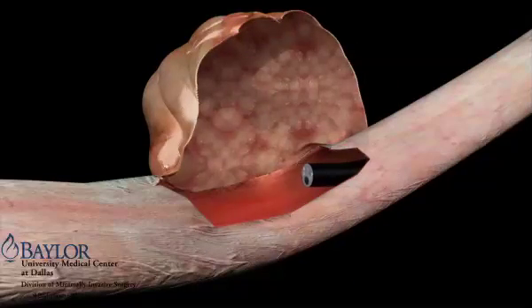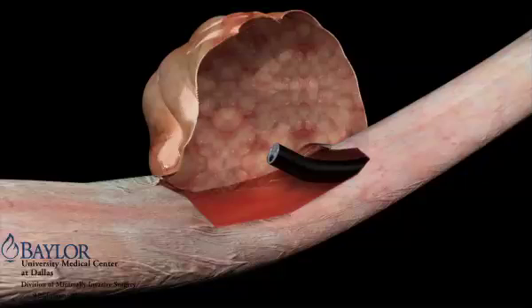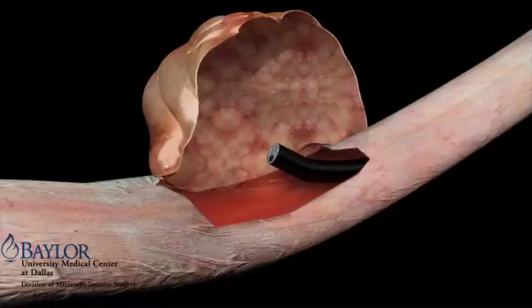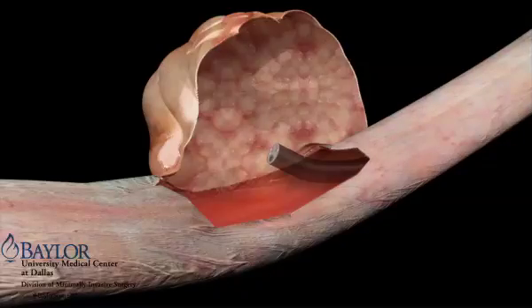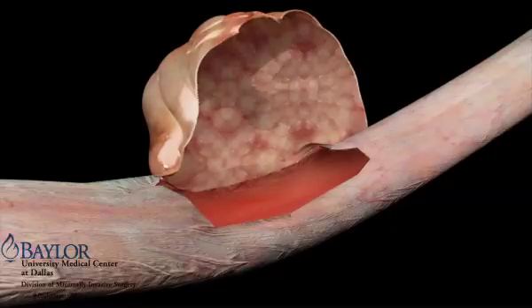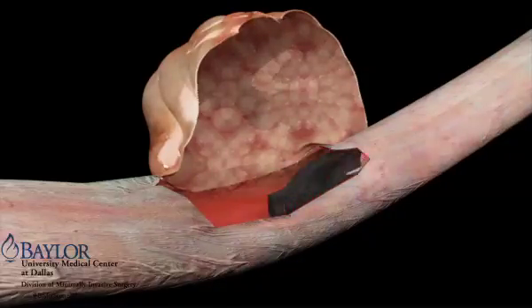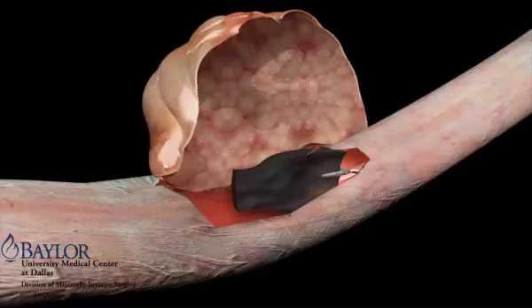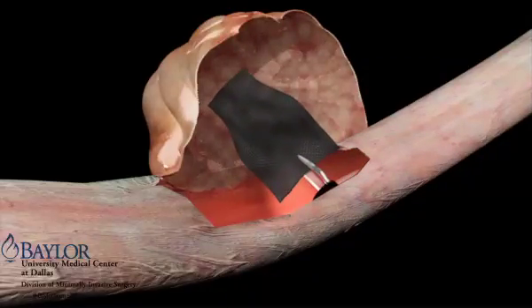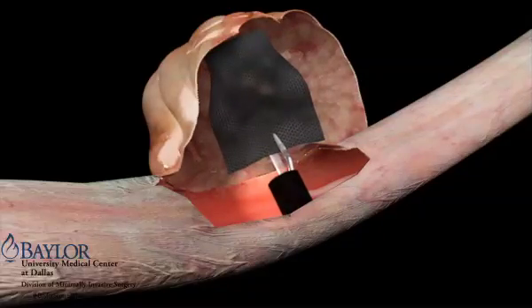The scope should be advanced through the perforation and into the cavity to explore it and irrigate the cavity. The endosponge is then created and carried down the esophagus to the perforation site using the endoscope. The endosponge should be advanced to the perforation site and inserted into the fistula cavity.